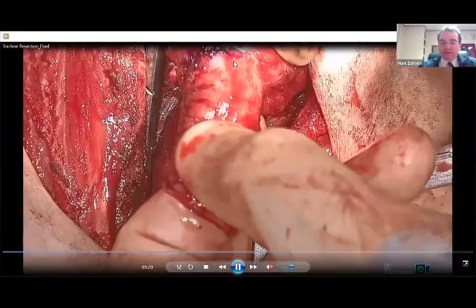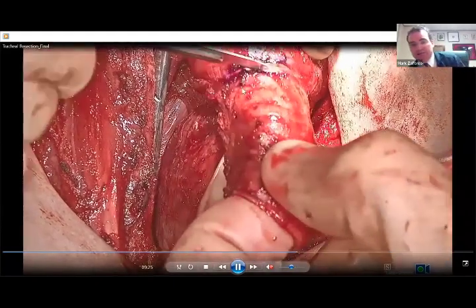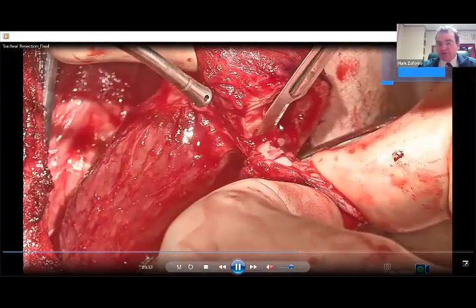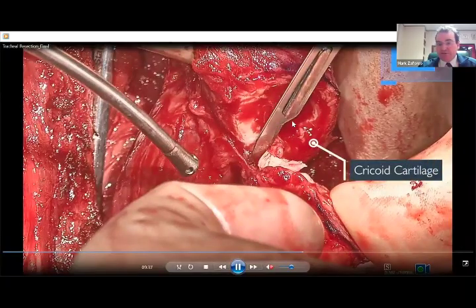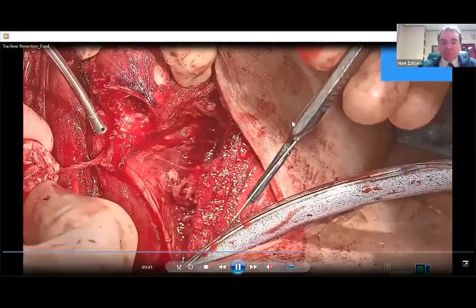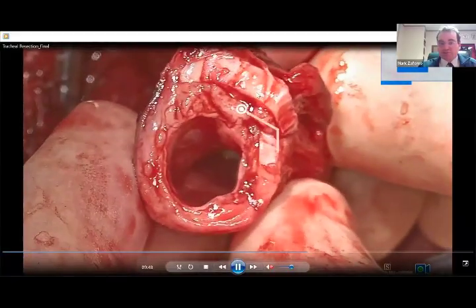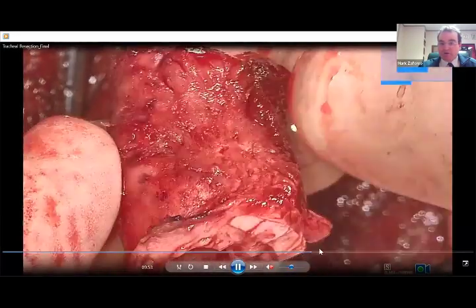In this case, we're taking it right off of the cricoid, which is the upper cut, the second cut. And then here you still see the endotracheal tube from the surgery. So we try to keep the patient intubated, and the NIMS tube is in there. If the patient accidentally gets extubated, you can always reintubate. This is the tracheal resection with a little bit of cricoid here, and you can see the tumor creeping up under the cricoid there.